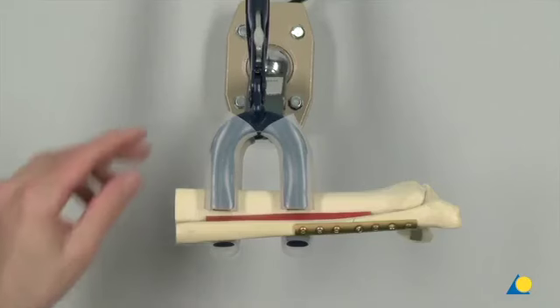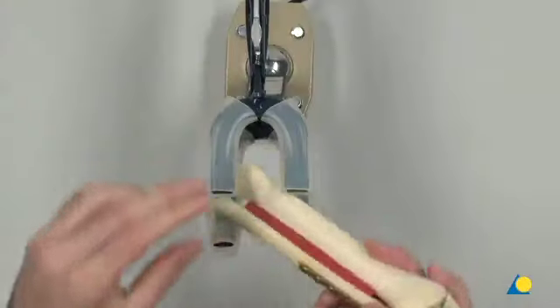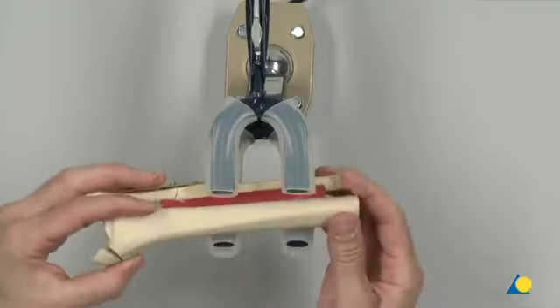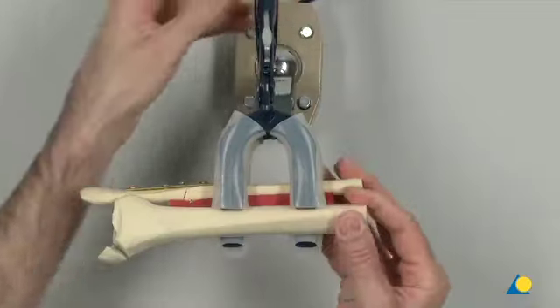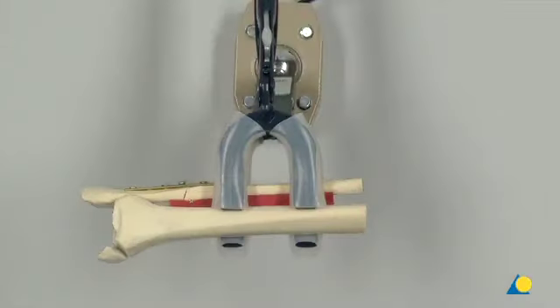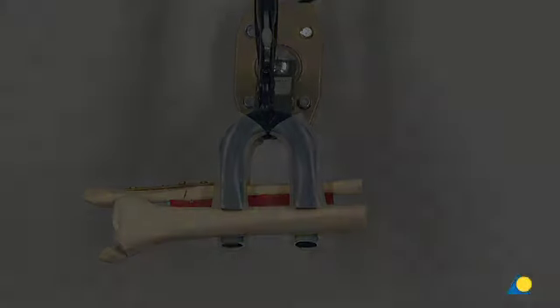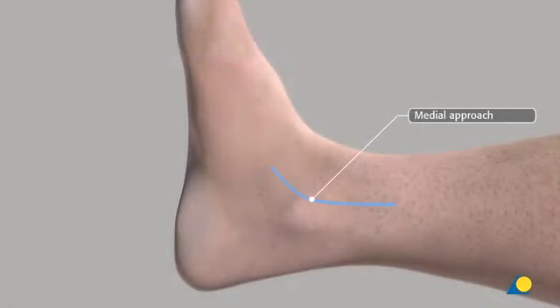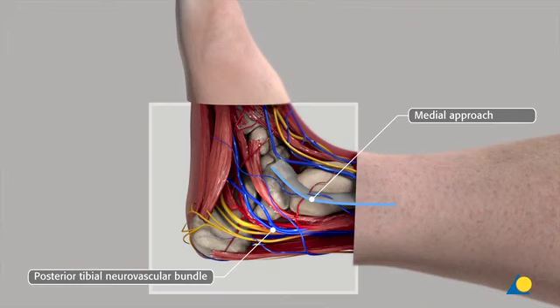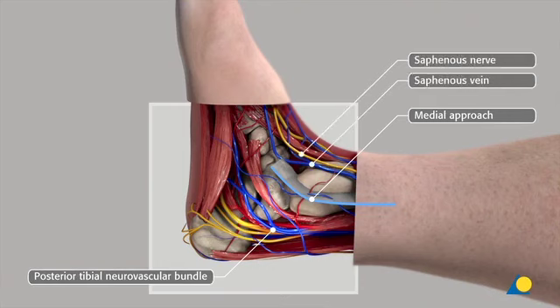To facilitate access to the medial maleolus, the bone model is rotated 180 degrees. The next step is the reduction and fixation of the medial maleolus. On the medial side, a medial approach is made through an anteriorly curved medial incision on the medial maleolus. The posterior tibial neurovascular bundle must be respected. The surgeon should be aware that the great saphenous vein and the saphenous nerve lie anterior to the incision.